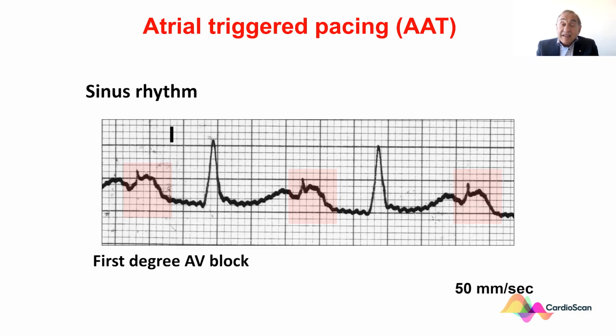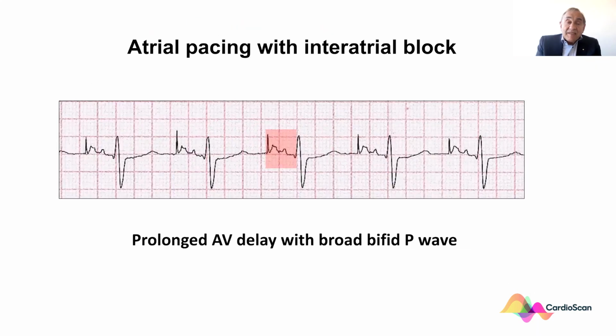In case there is inappropriate sensing, this would then pace, although at a faster rate than probably the sinus rate.